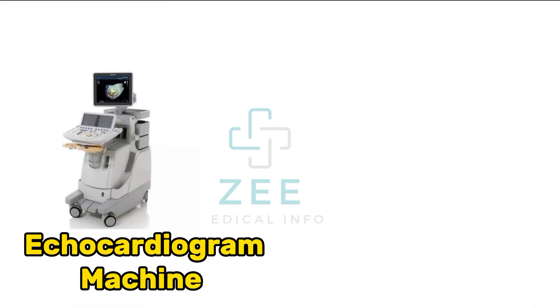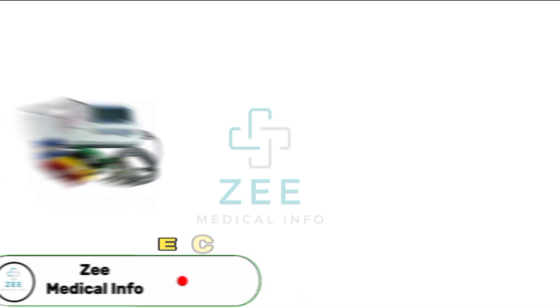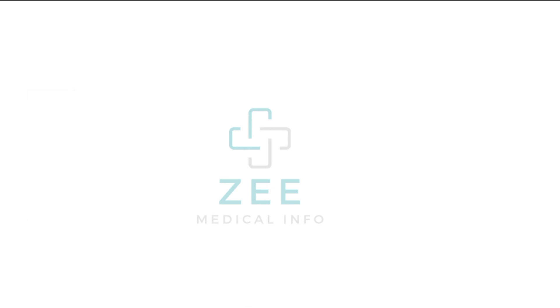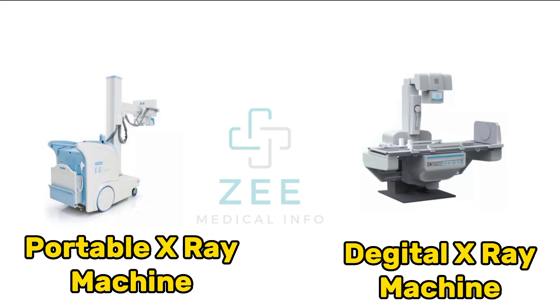Echocardiogram, ultrasound machine, ECG machine, mammogram machine, portable X-ray machine, digital X-ray machine.